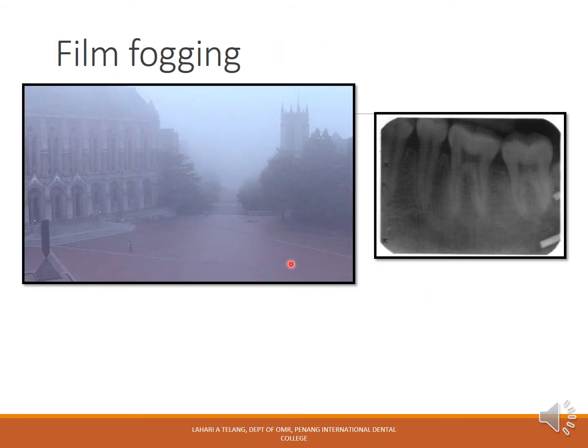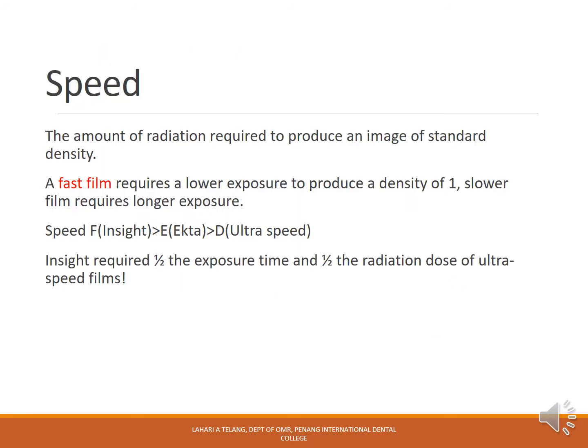Film fog, like we spoke about, is something which blurs the image and hence doesn't allow you to appreciate the details and cannot be used as a diagnostic image.